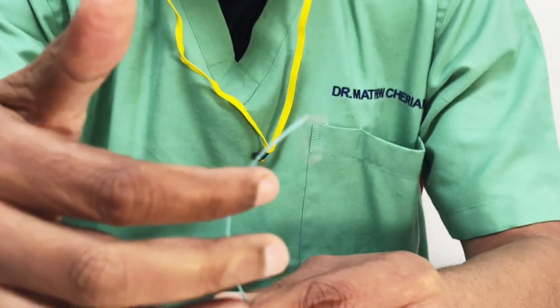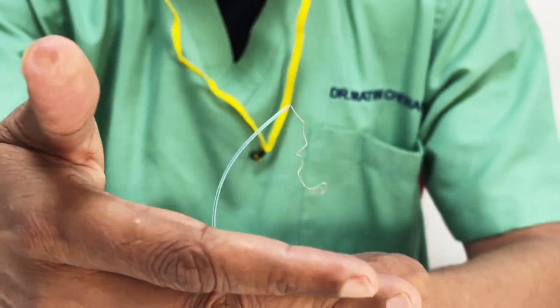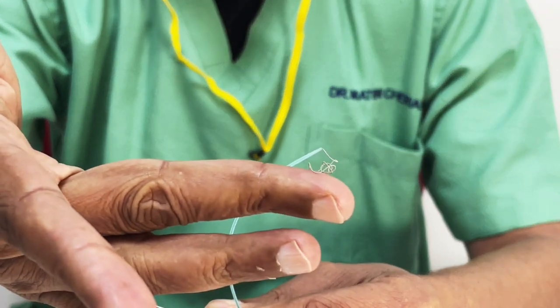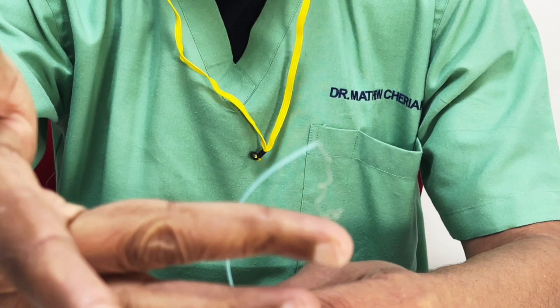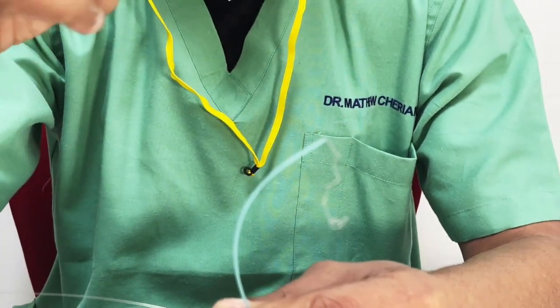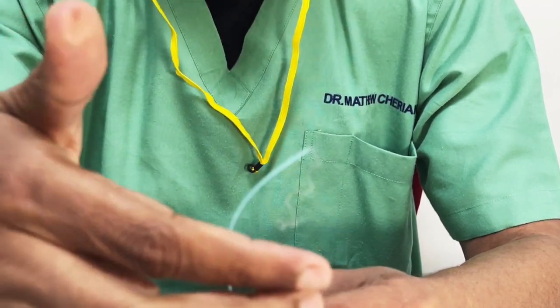So remember that. One is the shape. You can have shapes which are helical, or you can have these complex shapes which are 360. And this is a concept. Many different companies have different 360 configurations. Just to make you understand how it is done, they have a little knob-like thing onto which this is mechanically or hand wound and then baked in the oven to get this shape.